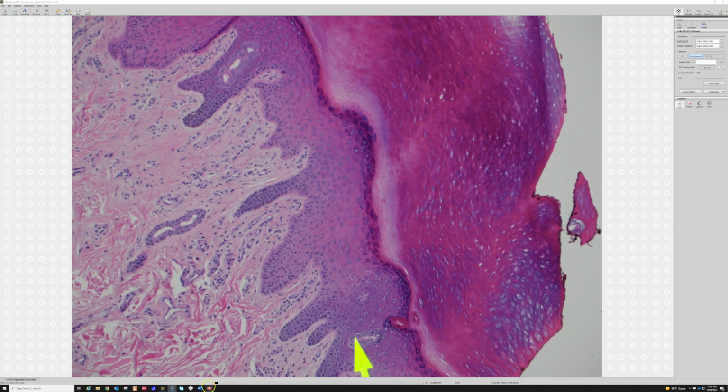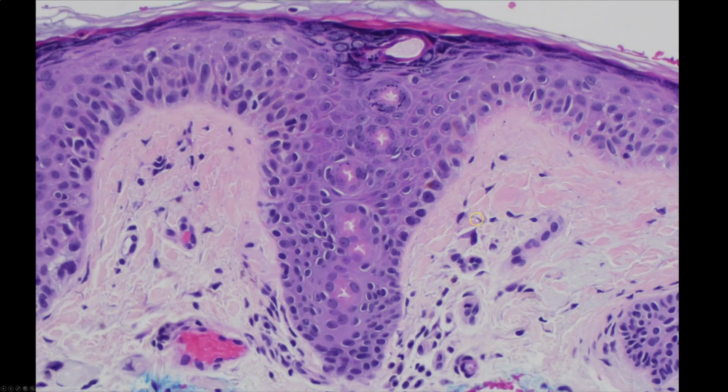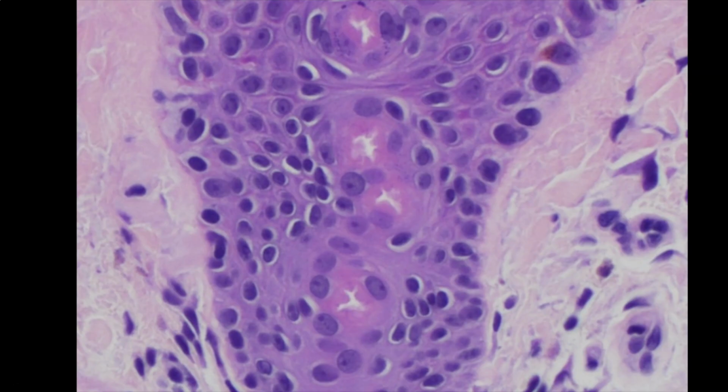And while we're at it, I've got another picture that shows what it looks like in non-acral skin, and you can see this one. This is all just one acrosyringium, one sweat duct emptying out to the surface, but we got a perfect section, and you can see it's kind of spiraling, and as we cut straight through that spiral, you see one cross-section, another cross-section, another, and see that little pink lining? That's typical of the sweat ducts. They have this cuticle, that pink lining that lines the inside of the duct.